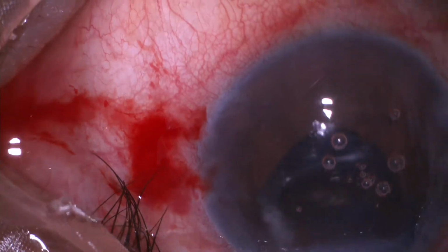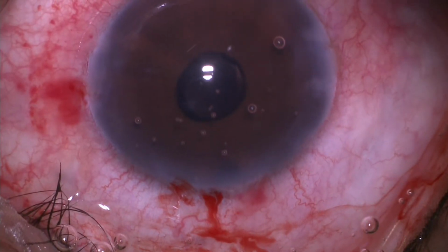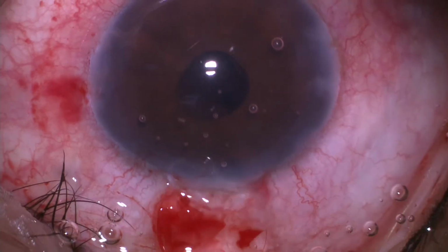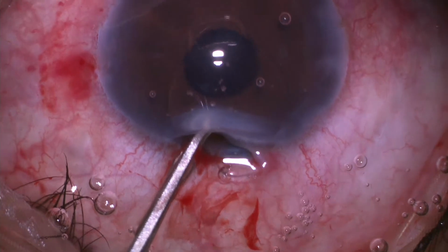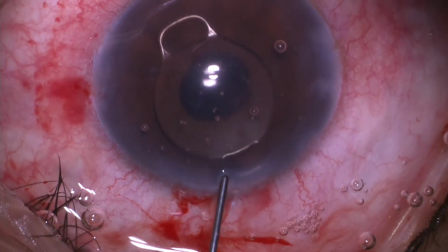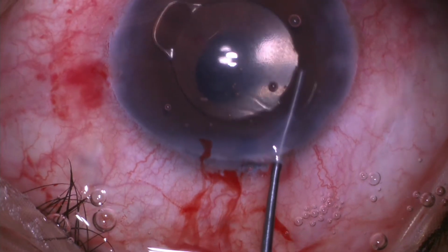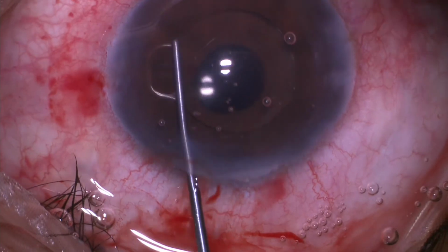IOL was explanted in toto. Pupil was constricted by injecting intracameral pilocarpine. Peripheral button iridectomy was performed. IOL was then inserted in anterior chamber. Since it was a vitrectomized eye, a very limited vitrectomy was required.